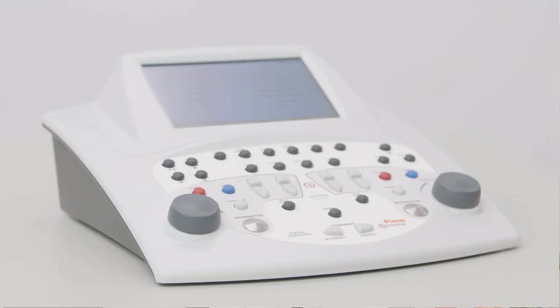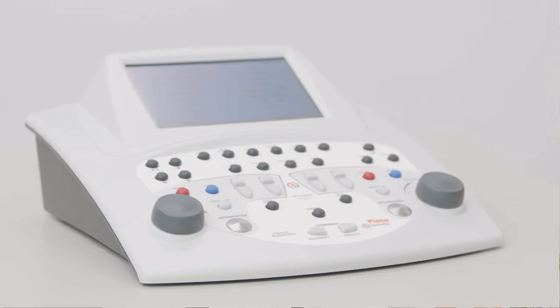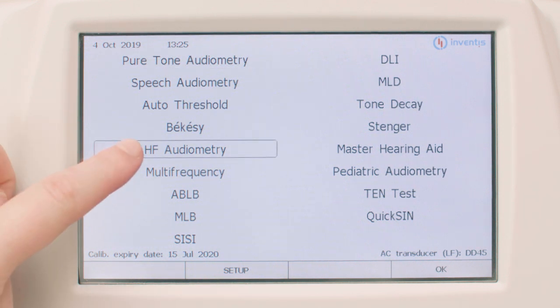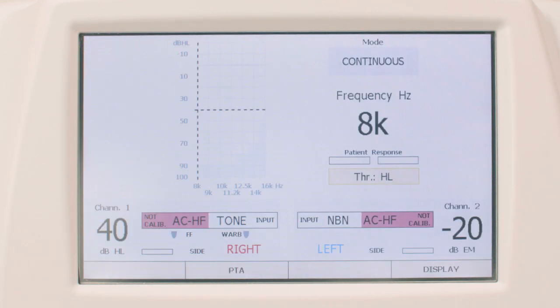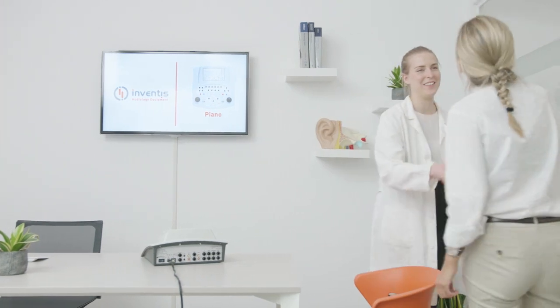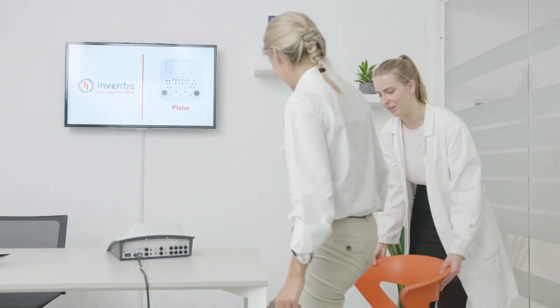The Piano is an advanced clinical audiometer with two separate independent channels. It features a complete set of tests including high frequency and multi-frequency, all easily managed by the wide touchscreen color display. Through the touchscreen you can control the exam settings and move through the windows of the user interface.